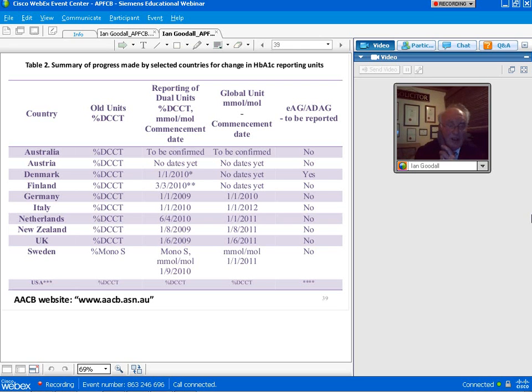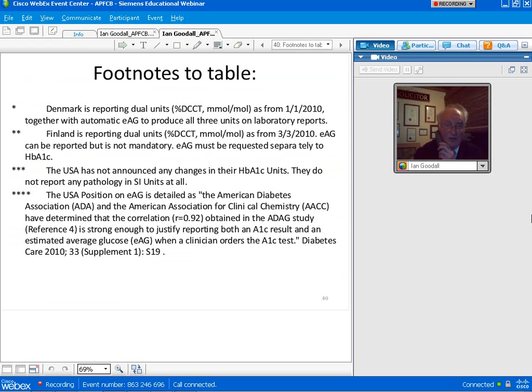So in 2002 there was a consensus statement by the Europeans, by the International Diabetes Federation, the IFCC, and the AACC, the American Clinical Chemists, and the numerical people, I can't remember what that is. But the clinical requirements of a hemoglobin A1C test include low individual variance, precision that justifies clinicians working on figures of 0.5%, and A1C assays with a CV of less than 2%. And that is really very difficult to achieve. There are very few assays that can achieve 2%.